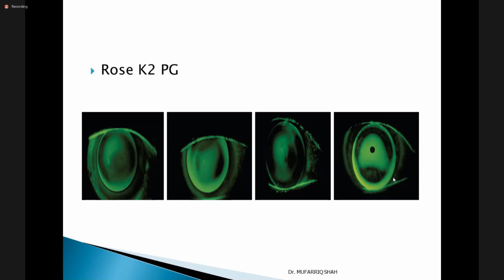So this is a little bit difficult for you because of the pictures. Anyhow, this is most important that you should know about. First, you should know, is it okay or not? Is the picture proper or not? So what about the second? Peripheral band is more, sir. Yes. Edge lift is greater. And what about the third one? Edge lift is less. Yes, tight edge lift.